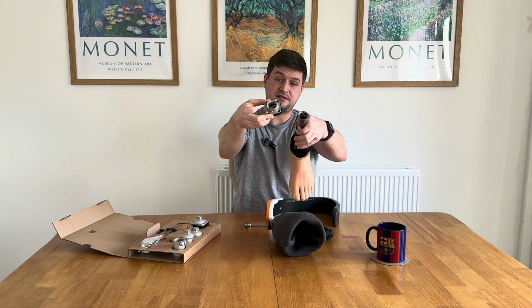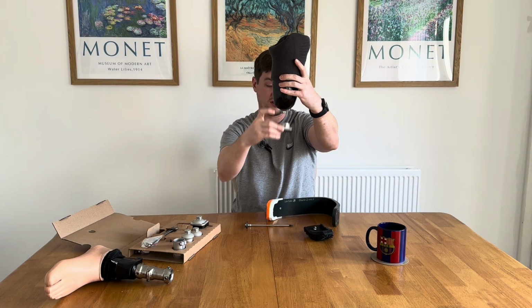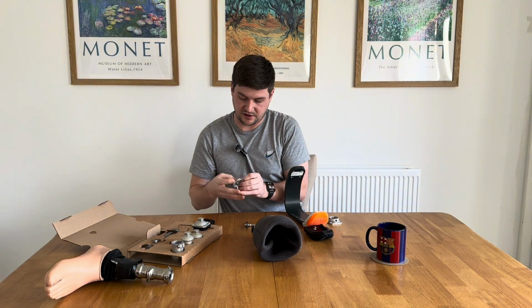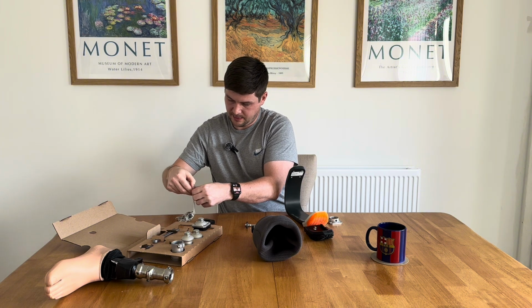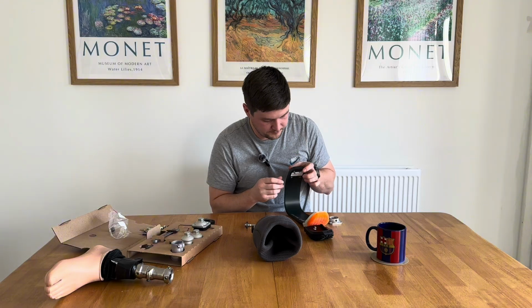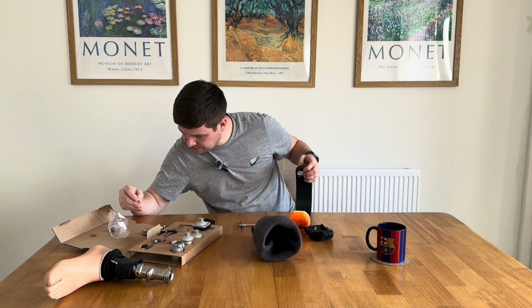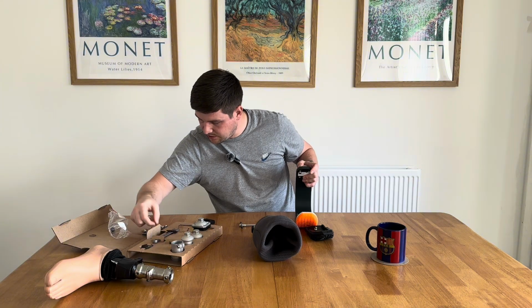A female part, that looks like a female part, to anchor onto a male part. That goes in there like that. And that mounts to there. So let's get that mounted. Use that. But we'll get the bolts out. It should be pretty straightforward, but I'm already losing myself. But yeah, what I think we're going to need is them, and a bolt, nut, another small one and a nut.